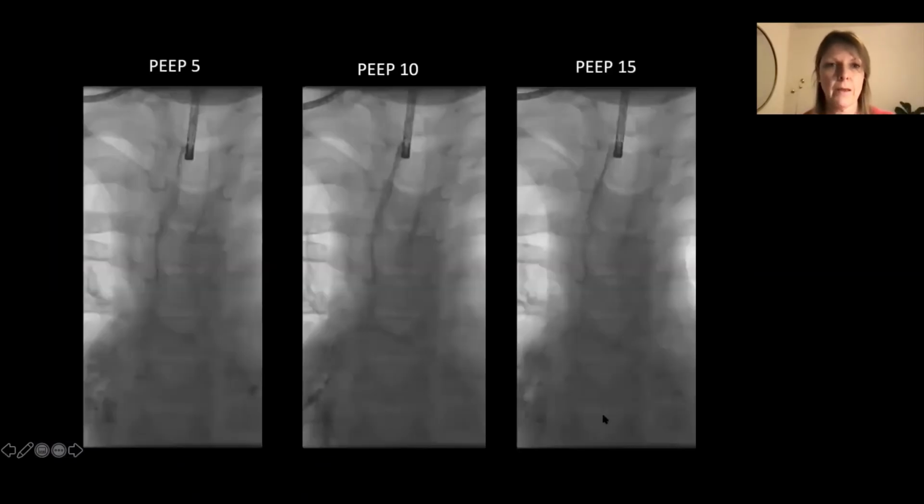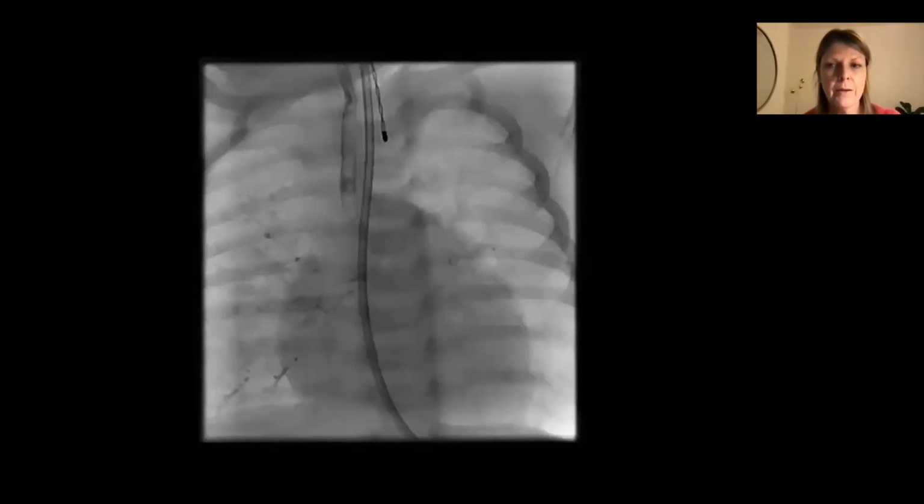We've put increasing levels of positive pressure through the airway here, and you can see as we've gone up on the pressure from 5 to 10 to 15, how that trachea has opened up beautifully, and that gives the respiratory guys a lot of information about how easily they can overcome the floppiness in this trachea and how they can treat it. This is a child with long segment tracheal stenosis, a very, very long, narrow trachea there.